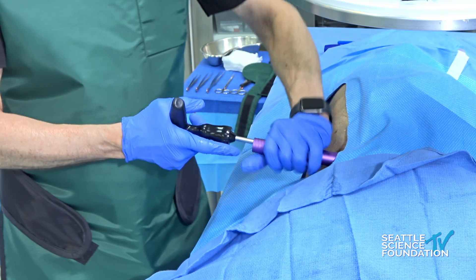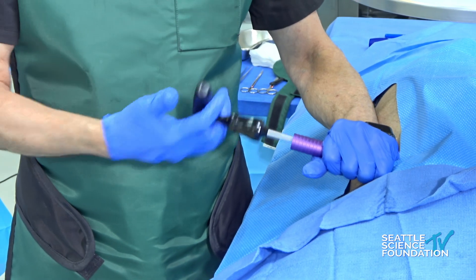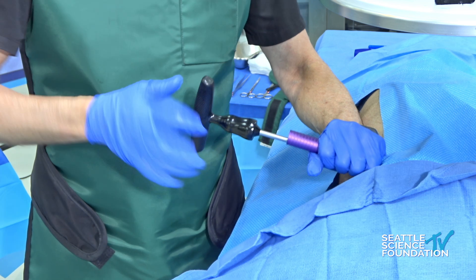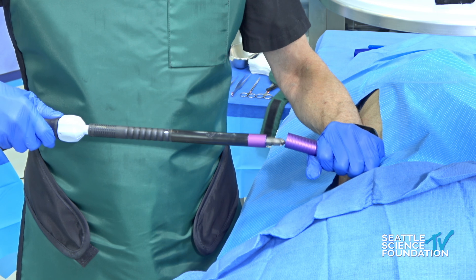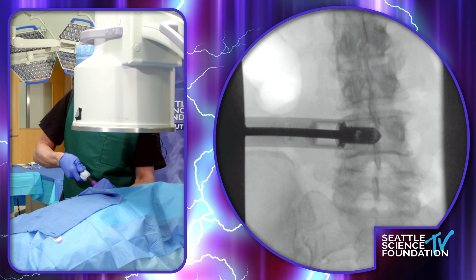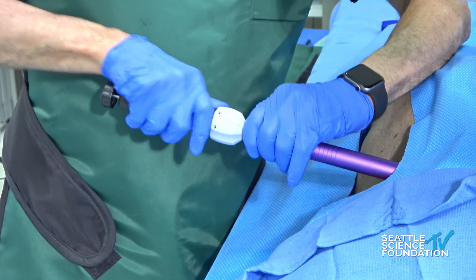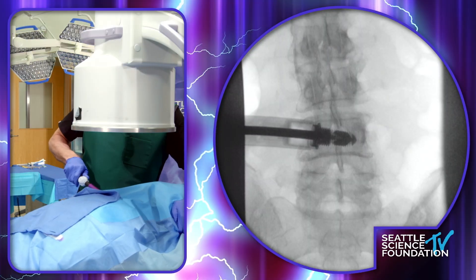So, this goes in. Next step, I'm going to remove the graduated tap. Seth is going to hand me the lightsaber — that is called the inserter — with the 12-millimeter implant on the end of it. Out goes the graduated tap. Your left hand is maintaining the alignment of the insertion tunnel? Exactly. And this is threaded too. Often this will collapse a little bit, and you'll have to reinsert by clockwise threaded implant. I'm going to reinsert all the way to the hub.